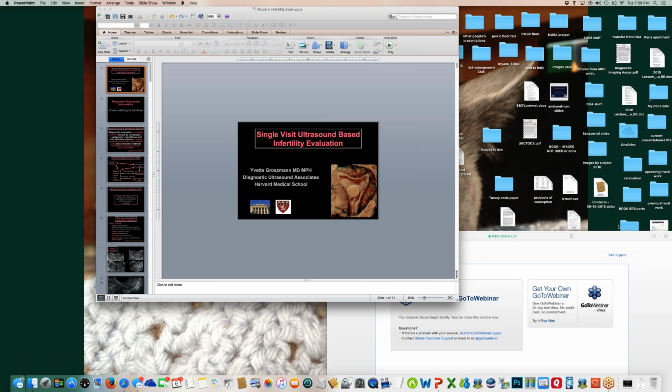Do you evaluate vaginal septa on ultrasound? Unfortunately, right now, ultrasound is not the best modality to evaluate for vaginal septums. That's the only time when I would say for now, MRI is better. However, there are people in Europe who are putting fluid in the vagina and doing ultrasound of the vagina. So I think we will figure out how to do it in the near future, hopefully.